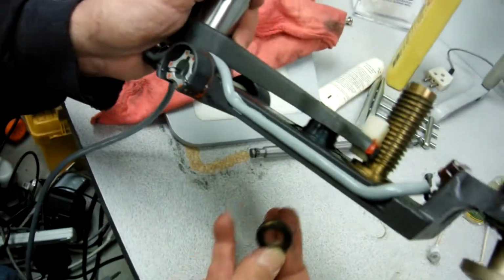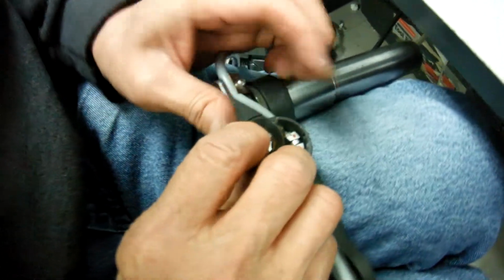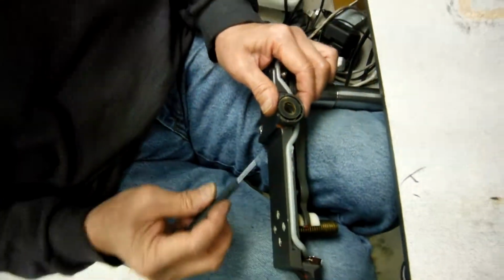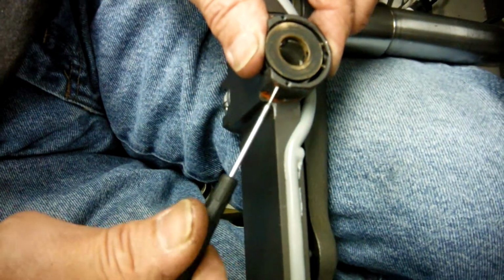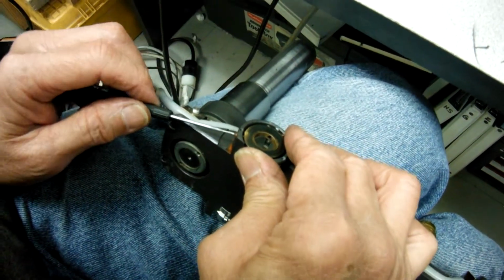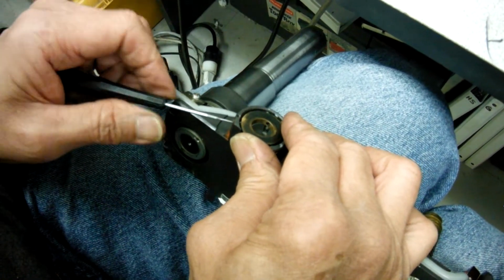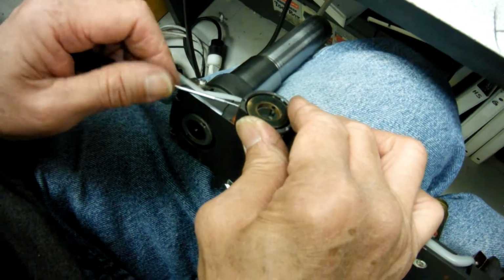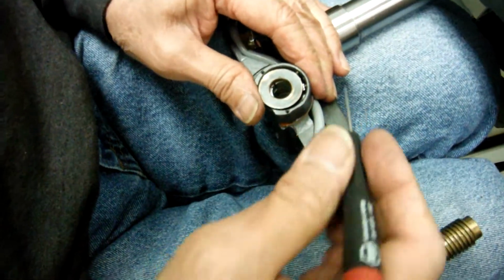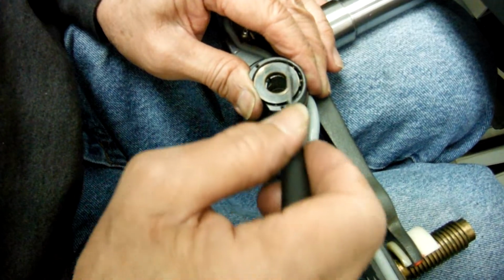of the place. So what you do is you leave it like this and put it right on the top right here and press it in there and then let it sit in there. Then you can turn these two screws. The two screws are for alignment, so the center will be right in the center. Okay, for right now you can use your eye to make sure the two screws adjust, so that will give you the even gap around here.